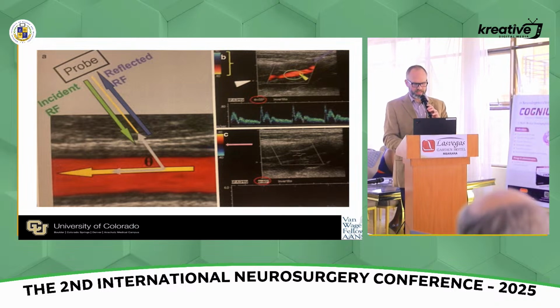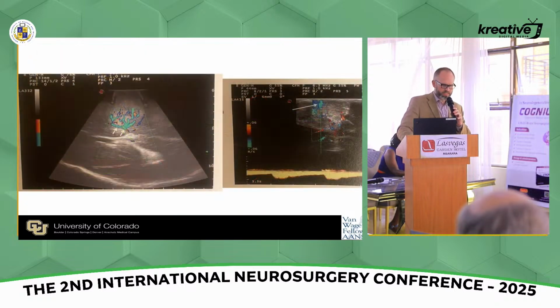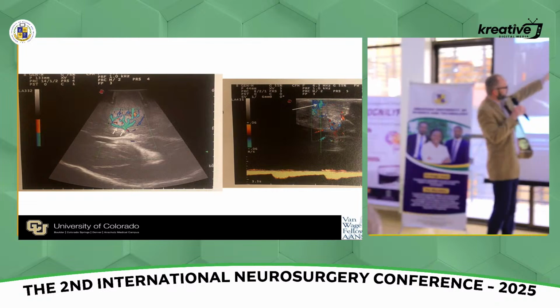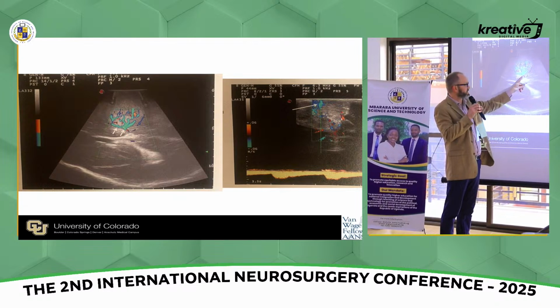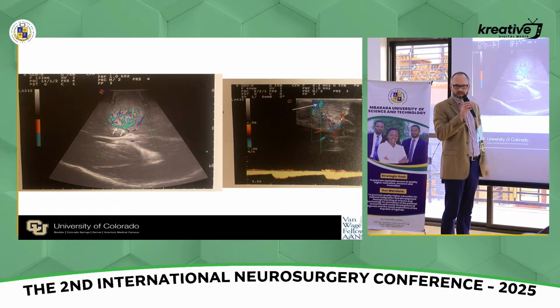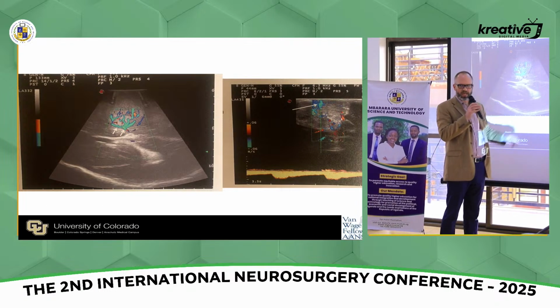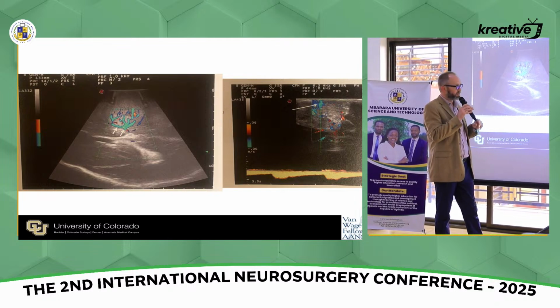the velocity. But I won't dwell on this too long because Dr. Kava is going to talk more about vascular imaging. But you can see that when you turn Doppler on, this is a tumor. And Doppler here is very useful to see the vascularity of the tumor. You see where its originating vessels are in this sequence. That can guide resection and where you need to get hemostasis to reduce bleeding.